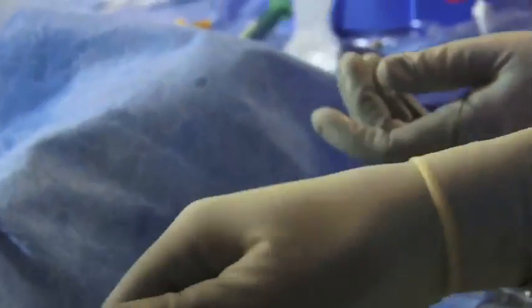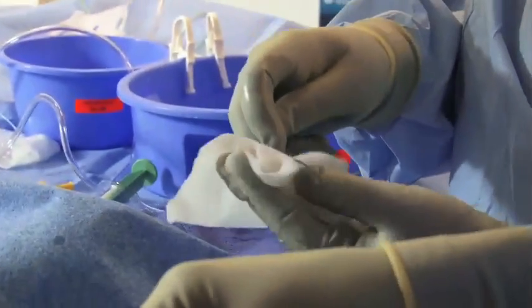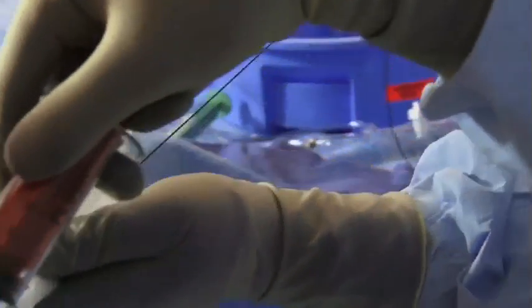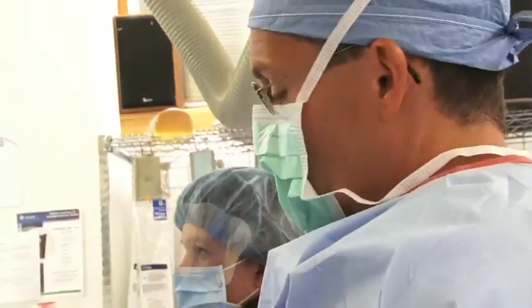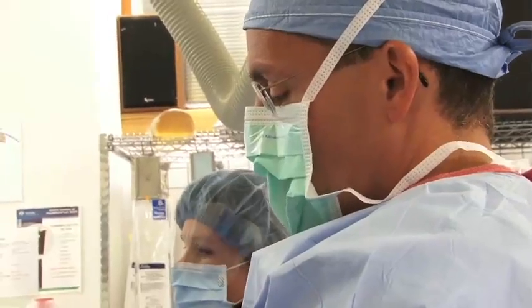But we also perform oncology procedures whereby we can treat tumors within the body by either burning them at high energy with a radiofrequency ablation type probe or freezing them with a cryoablation type probe. Those are two of the main technologies that are really state-of-the-art treatments for cancer therapy.